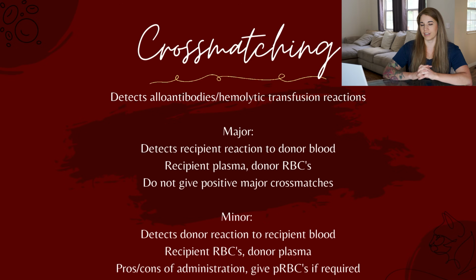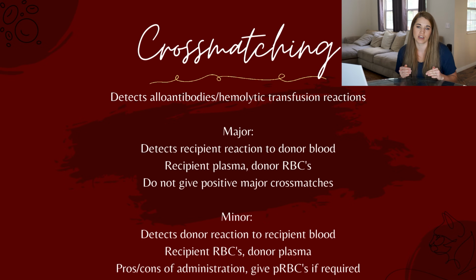Minor cross-matching tests for a reaction in our donor to the recipient blood. So for a minor cross-match, you need donor plasma and recipient red cells to see if there's a reaction in which our donor is not going to be compatible with our recipient's blood.